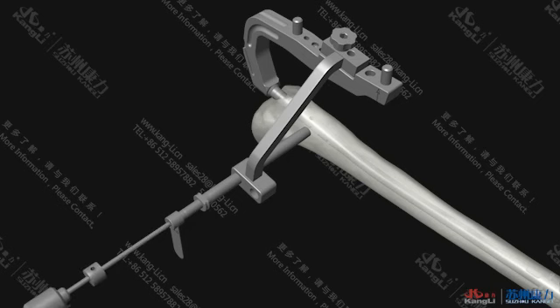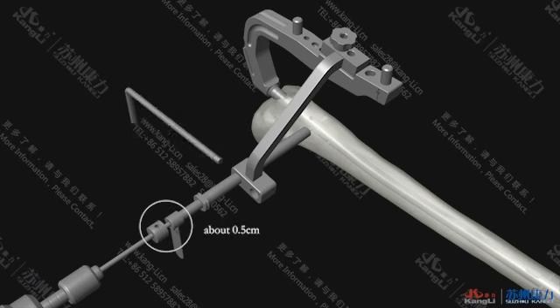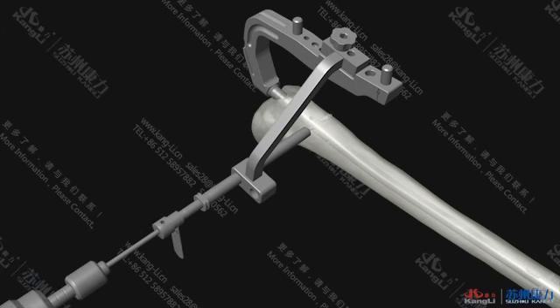When the first layer of the bone cortex is drilled through and the drill bit reaches the inner wall of the contralateral cortical bone, adjust the distance between the ball spike on the phi 4.0 drill bit and phi 4.0 inner sleeve to about 0.5 cm using an SL wrench to protect the soft tissue of the contralateral skin. Then continue drilling until the contralateral bone cortex is drilled through.